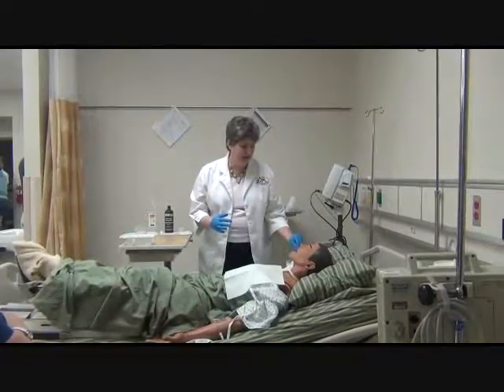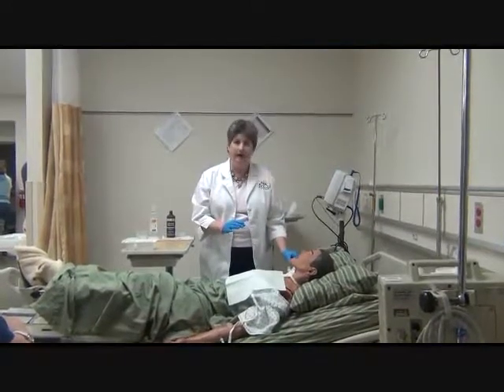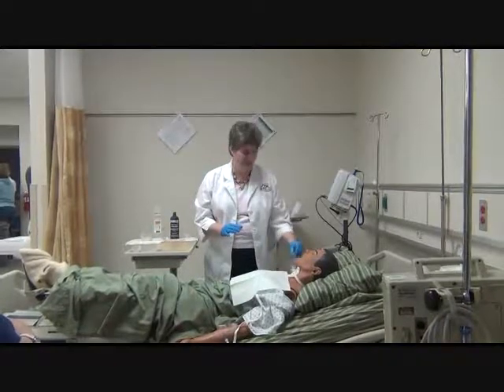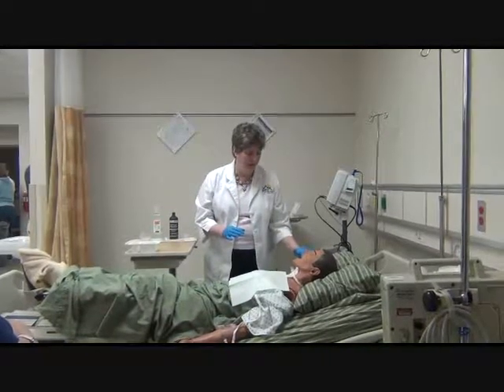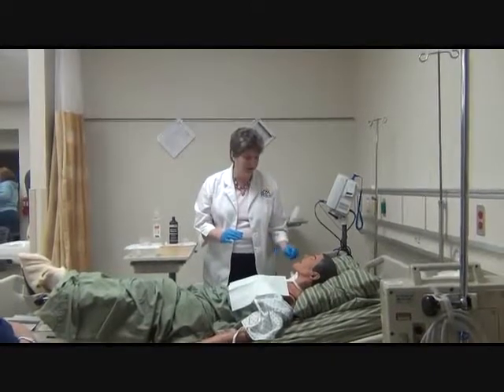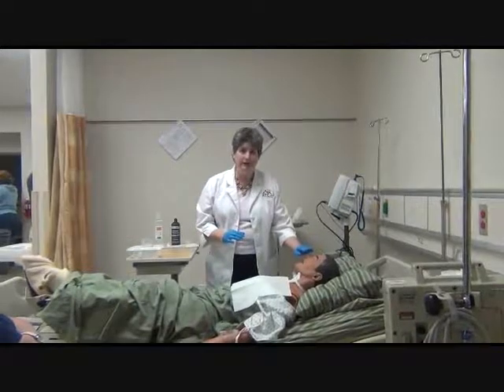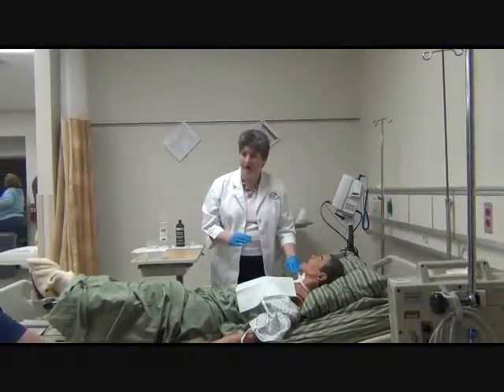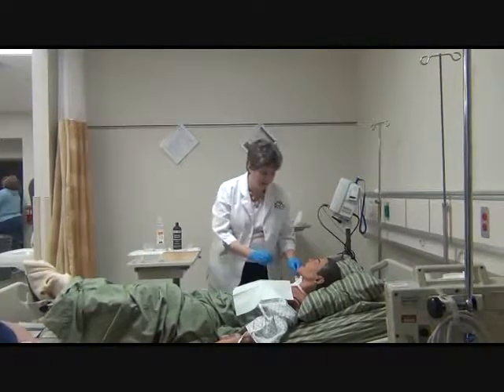If this patient needs oxygen while I'm doing this, I can have someone assist me by holding the oxygen on so that the patient is getting oxygen during the procedure. It doesn't do you good to put the oxygen by their nose because they're breathing through this hole. So remember that the oxygen has to come through the trach.